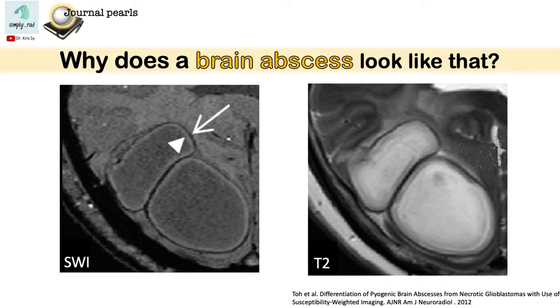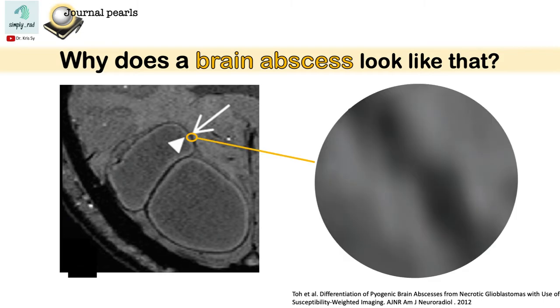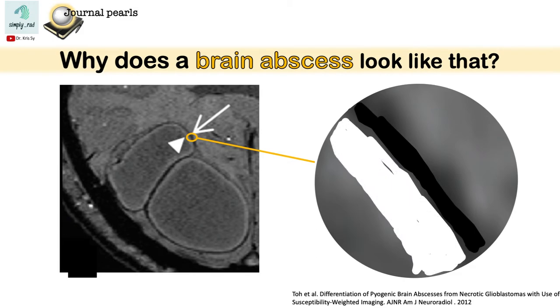So why would abscesses look like this on MRI? If we take a closer look at the rim, we will see that it has an outer dark line and an inner bright line. This is called the dual rim sign.